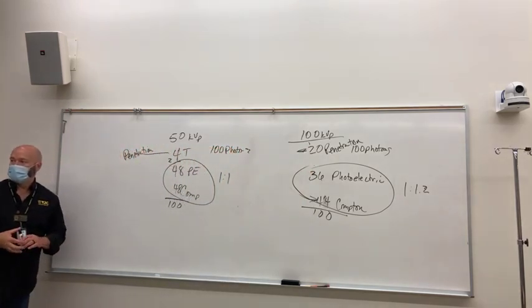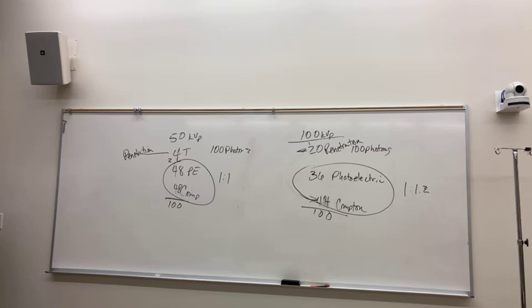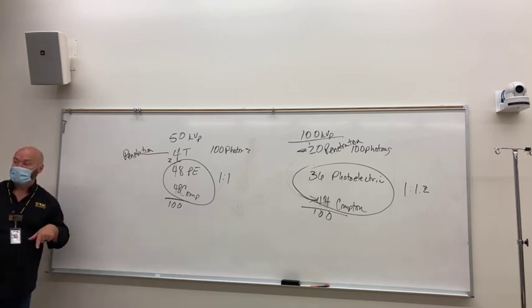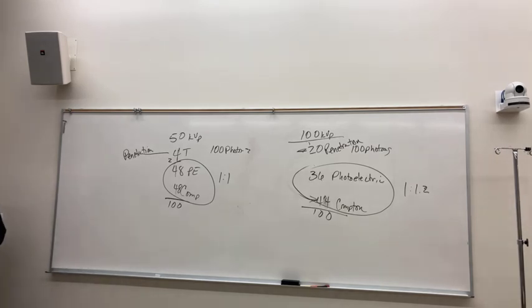Okay, so when it says, then why do we say that Compton's go up, it's because an increase in kVp will decrease PEs, and your Compton interactions now dominate your image. As you increase kVp, photoelectrics decrease. As kVp goes up, photoelectrics decrease, and Compton's decrease as well, but photoelectrics decrease at a higher rate than what Compton's do.